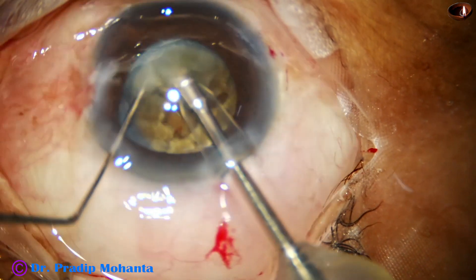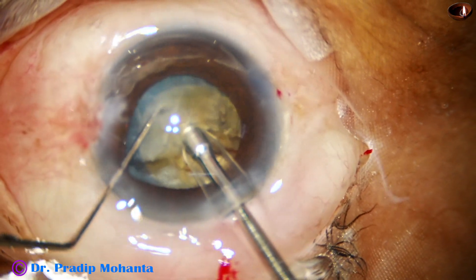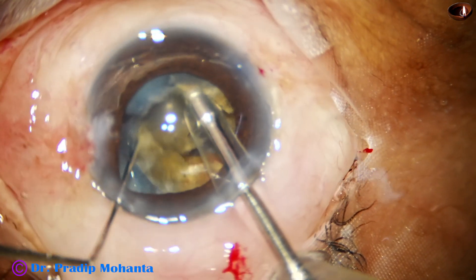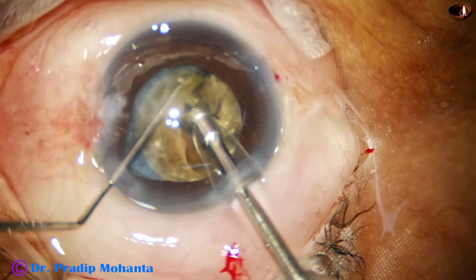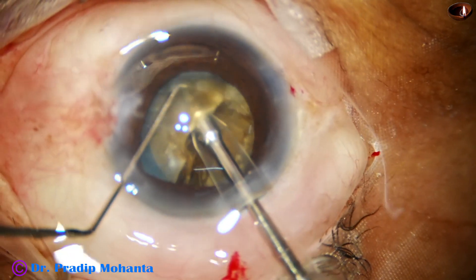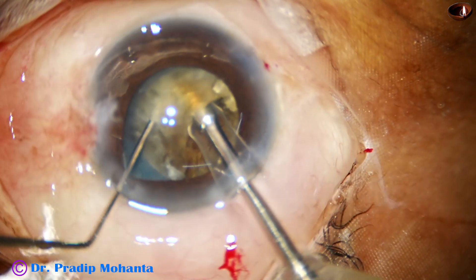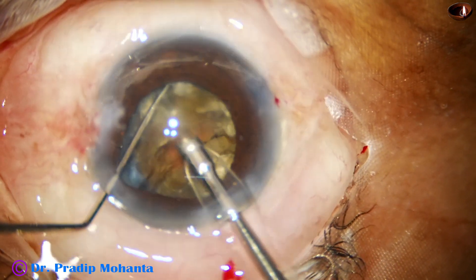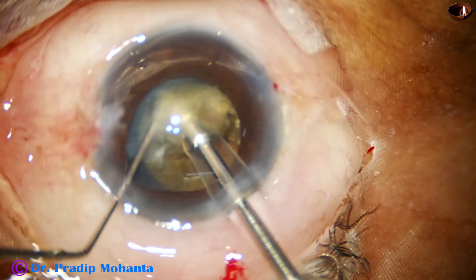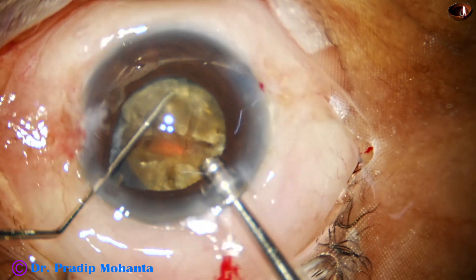This fragment appears to be free — the fragment I just got now. Then I get another crack on the hemi-nucleus. The hemi-nucleus, which is not completely separate from the other hemi-nucleus, has been divided into three not-free fragments. The fragments are still joined to each other by some leathery fibers, and this kind of cataract is really tough to manage.